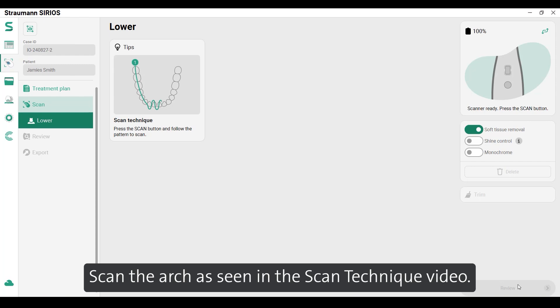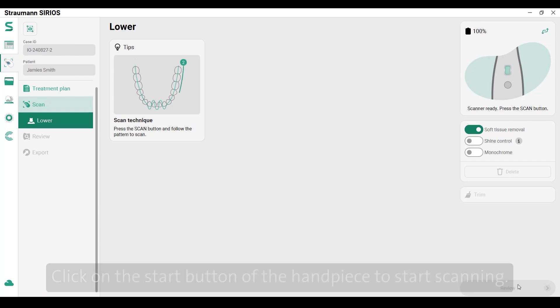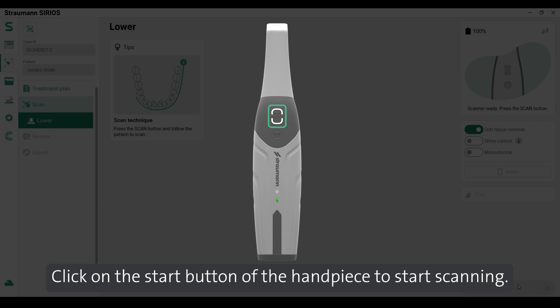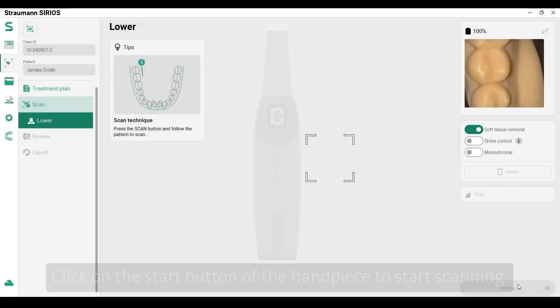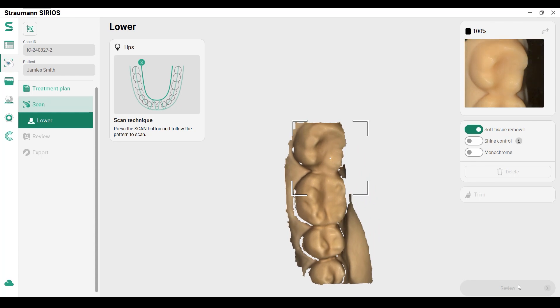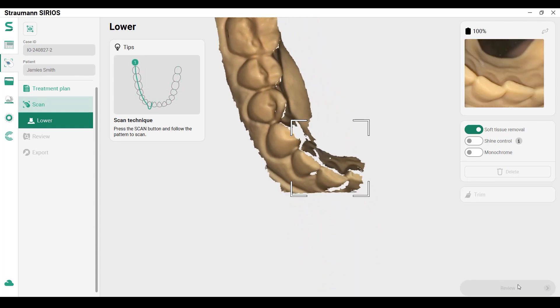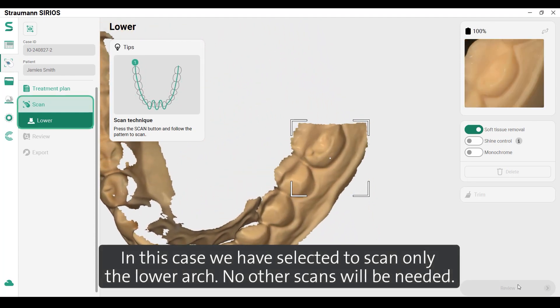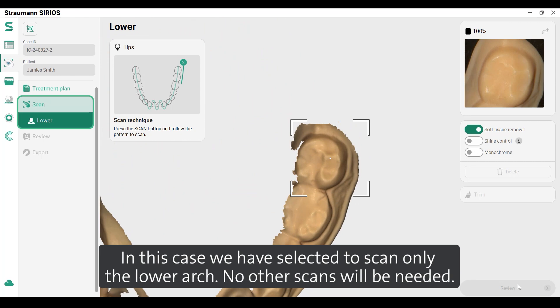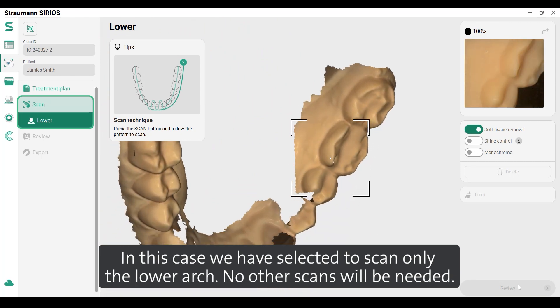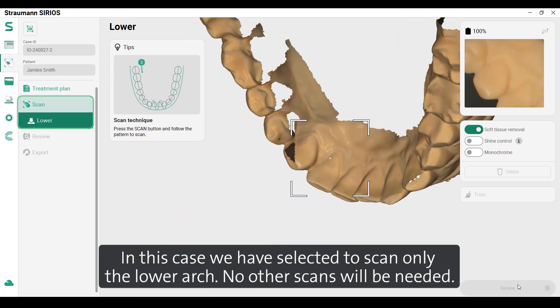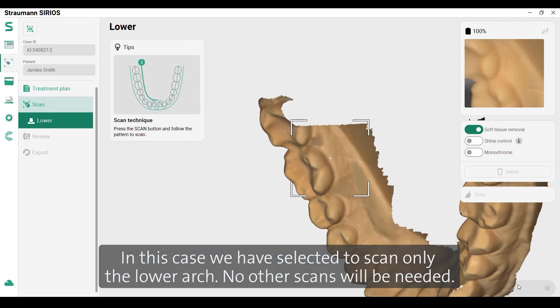Scan the arch as seen in the scan technique video. Click the start button on the handpiece to begin scanning. In this case, we have selected to scan only the lower arch — no other scans will be needed.